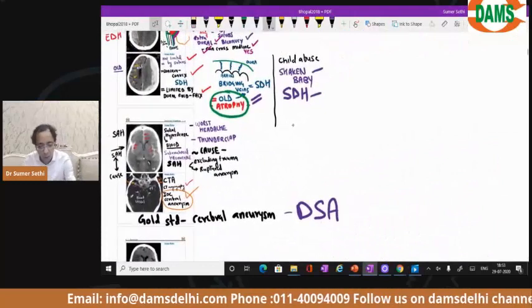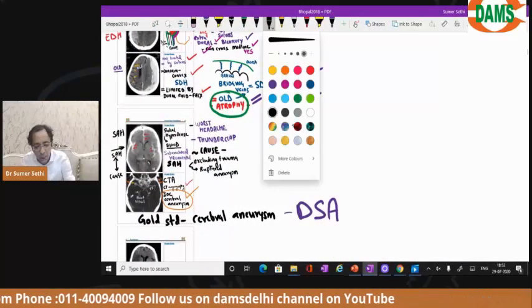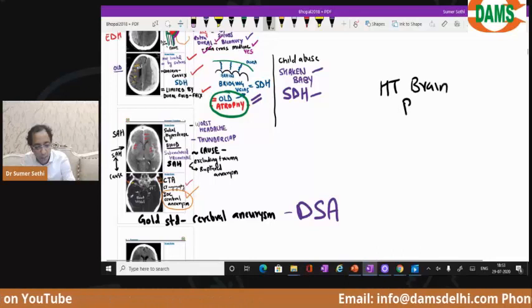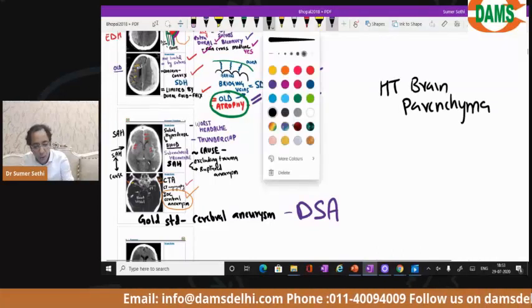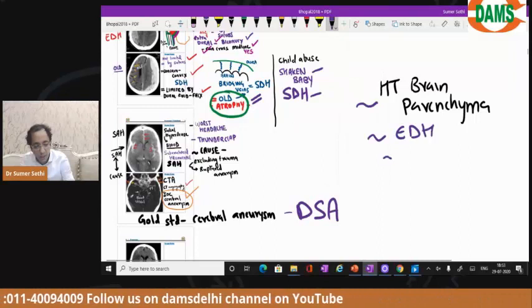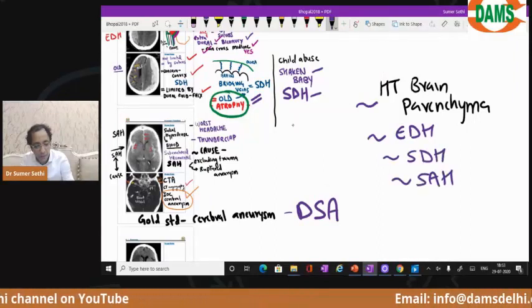Now, so what did we learn so far in the class was, I explained to you about CT, normal CT brain, then I explained to you hypertension से जो ब्रेन पैरेंकाइमा में हेमरेज होता है वो कैसा दिखेगा, and other causes will be there like amyloid angiopathy, so what will happen. Then I showed you how to identify EDH, SDH, SAH.